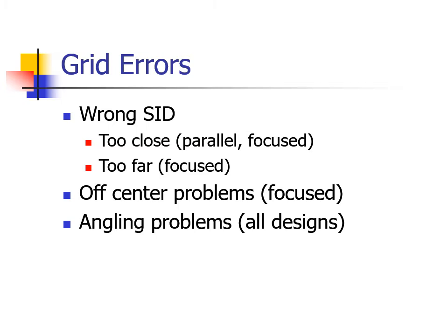One can angle along the length of the grid, but not across the grid's width. In a typical X-ray table, we can angle along the length of the table, but not across its width. When doing views that involve the bucky tray, angling across or allowing the grid to tilt across its width will cause a cutoff artifact.